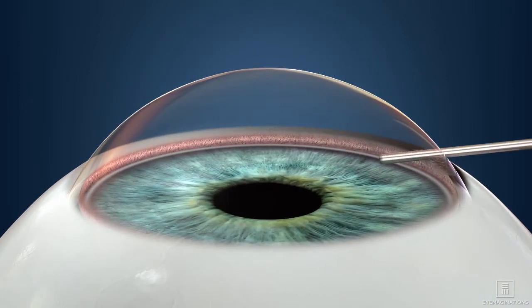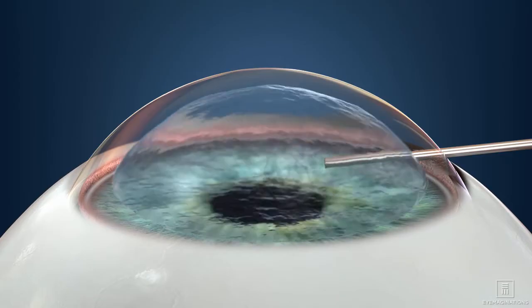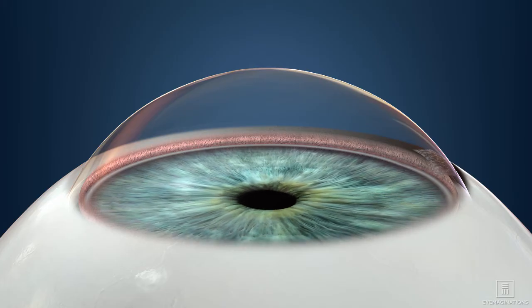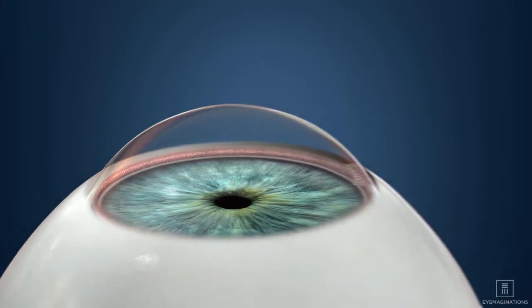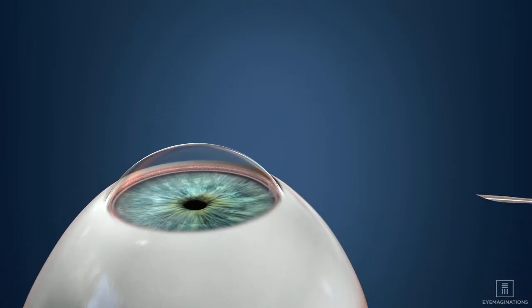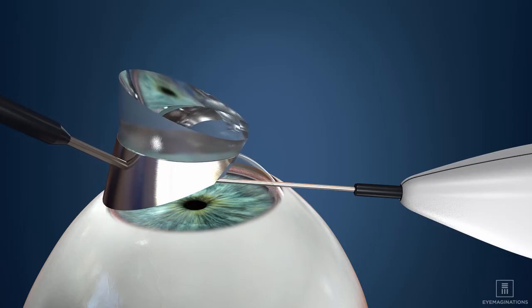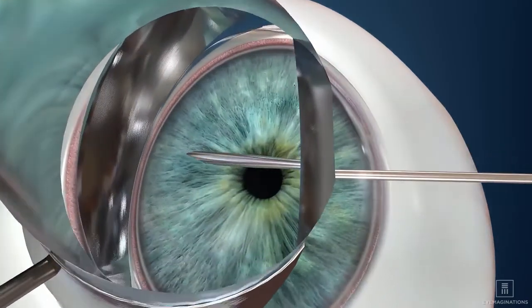Next, a gel is injected into your eye. A medication may also be added to make your pupil smaller. The Eye Stent Inject system is then inserted to access the angle of your eye. A special lens is placed on top of your eye so your doctor can see inside.